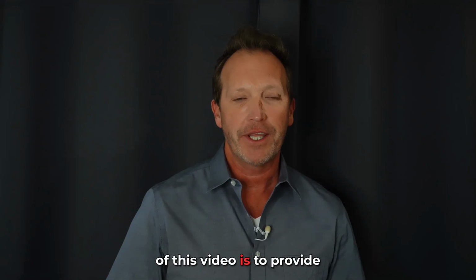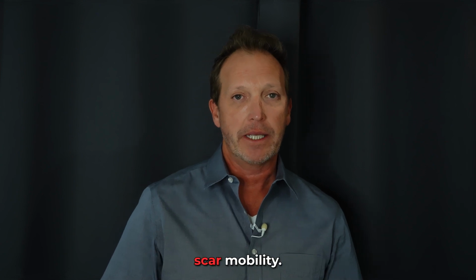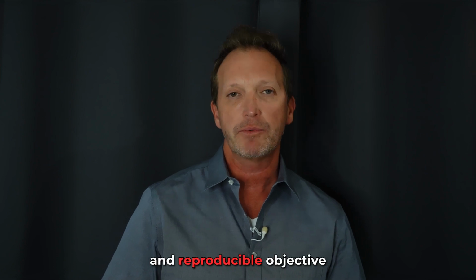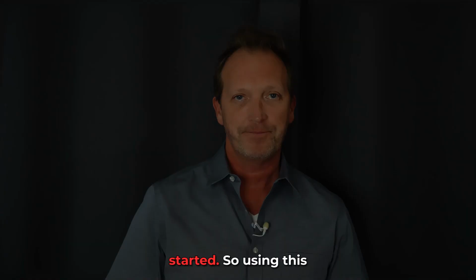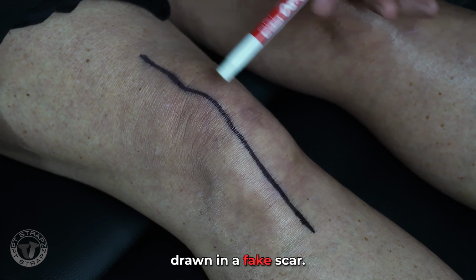The purpose of this video is to provide the clinician a method of measuring and documenting scar mobility. Being able to measure the scar mobility consistently will give you reliable and reproducible objective data, proving progress to yourself, to your patient, and to the insurance company. So let's get started. Using this subject for our scar mobility measuring, we've drawn in a fake scar.